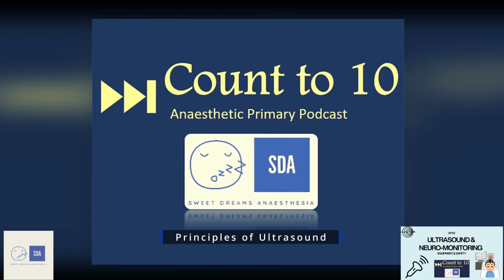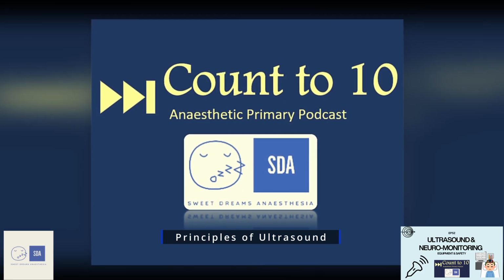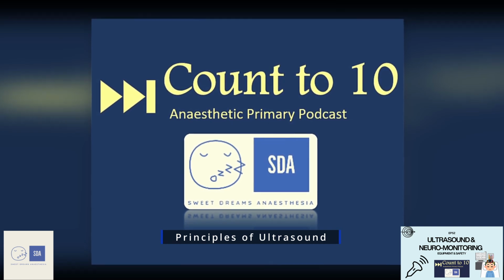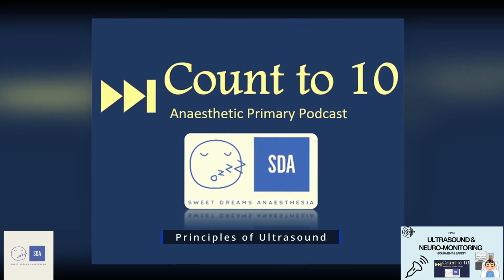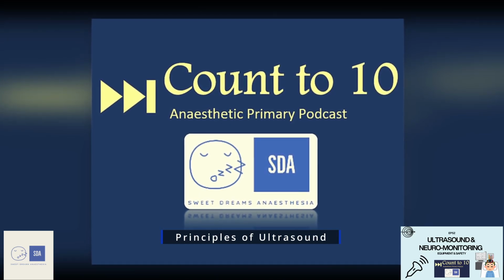Reflection of an ultrasound wave describes the ultrasound wave hitting a tissue medium and returning directly back to the probe itself. And we require reflection to occur because without that ultrasound wave coming back to the transducer, we would have no image on our ultrasound screen. So reflection is key and the most important factor when it comes to generating an ultrasound image on your screen.